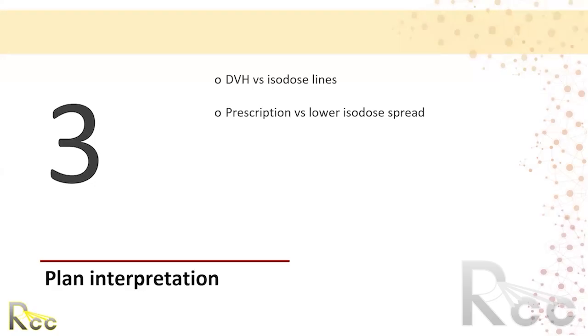Actually, we can't get the point dose. Can we get the point dose from DVH? Yes, the point dose you can get from the DVH. I'll show you now. Depending on what your planning system is, you should have different columns in the analysis of the DVH: minimum, maximum, mean, and you can also personalize it. So just explore a little bit more with your DVH options. But yes, everything you told me now, I can get from the DVH.